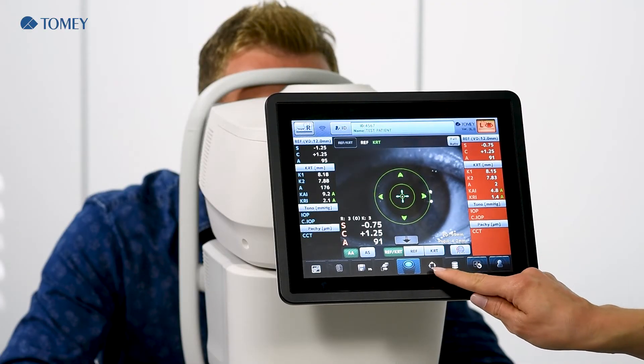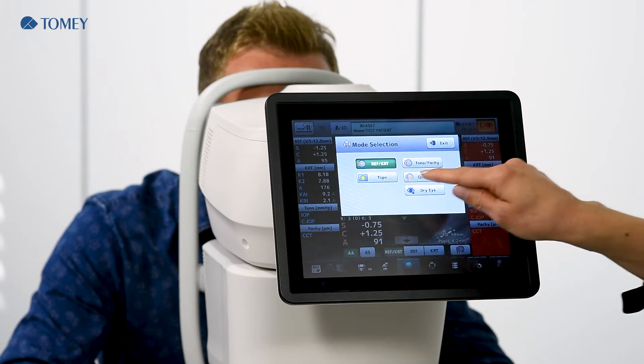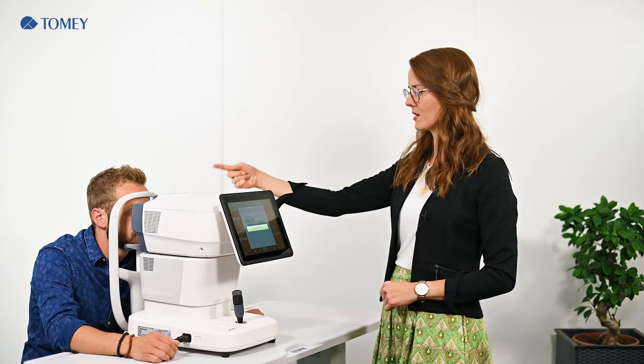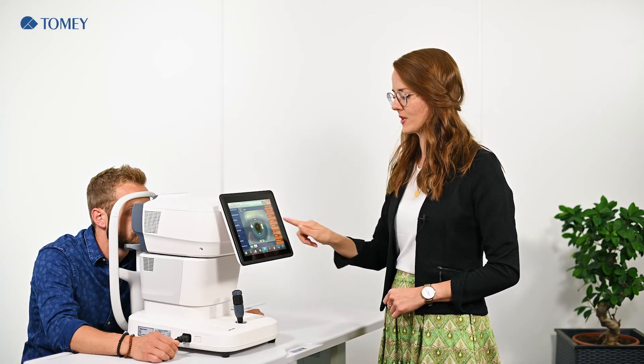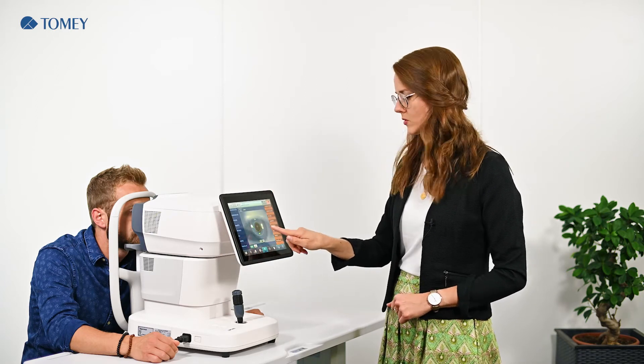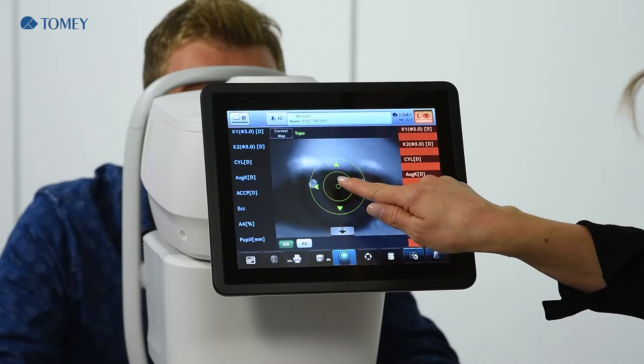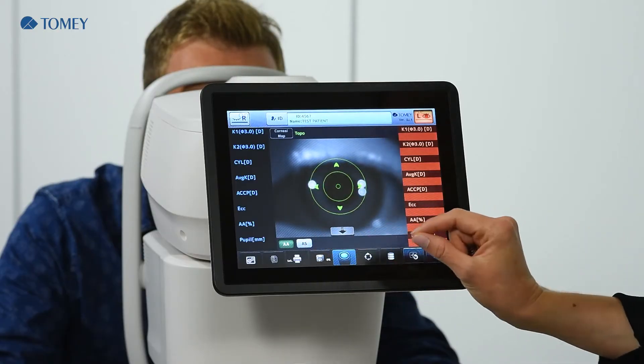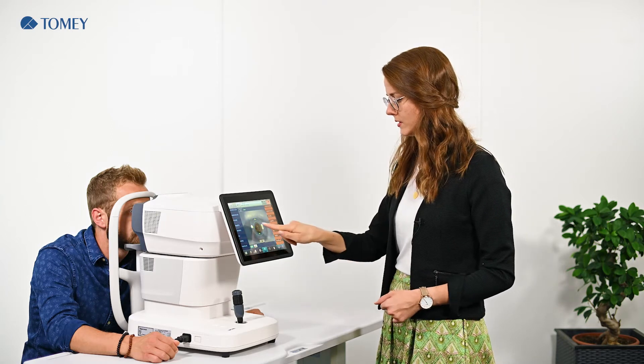The mode change button is below. Now we select the topography, because the topography uses the same cone for the measurement as the refraction and keratometer. Here you see that the outer shot button is deactivated. This is because the patient should blink one time before the measurement is taken to have the tear film closed on the eye surface.